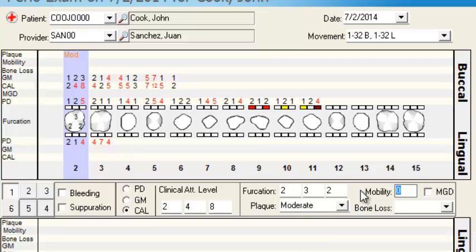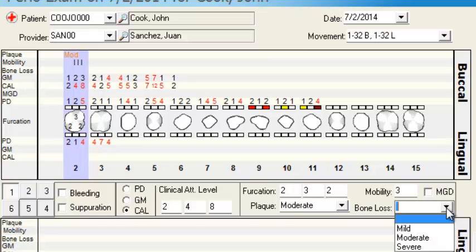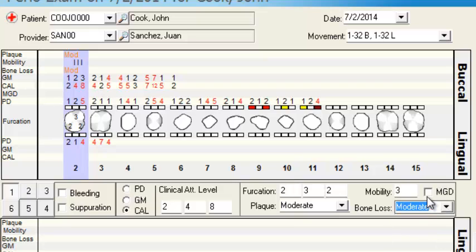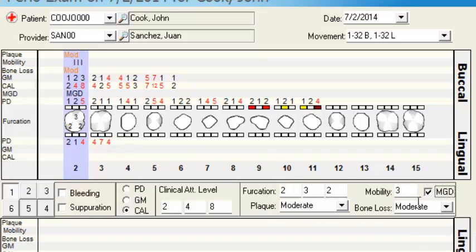For mobility, you have the option of one, two, or three — pressing three on the keyboard enters a level three mobility. For bone loss, you can choose mild, moderate, or severe. And then you have your muco-gingival defect — loss of healthy pink gum tissue — which you can select by tooth as well.